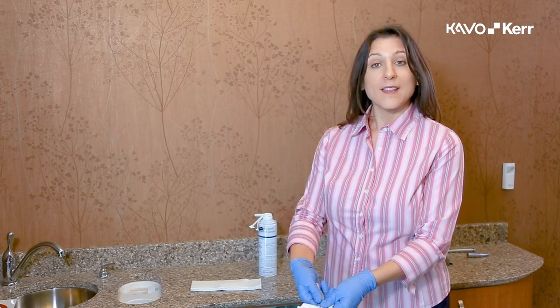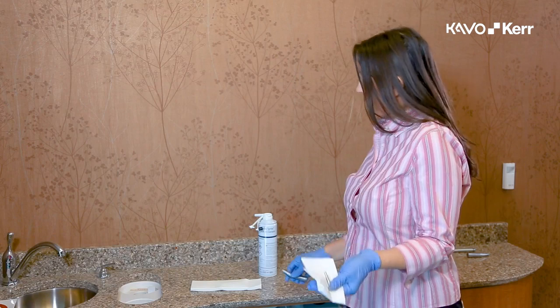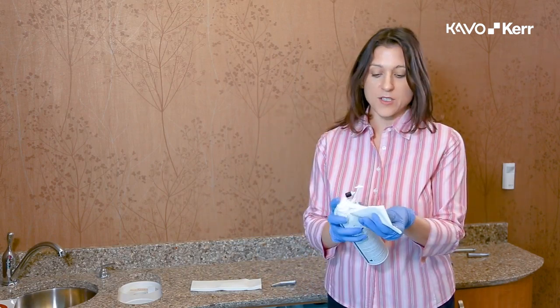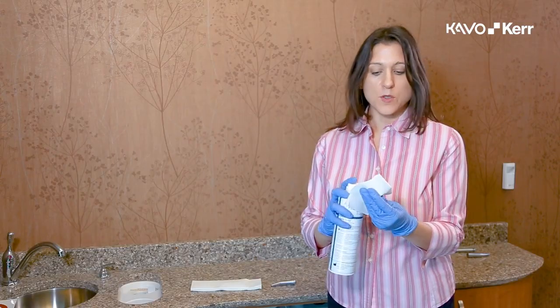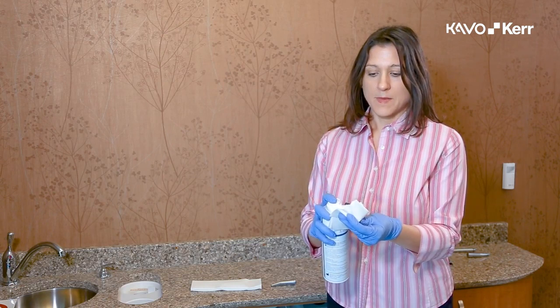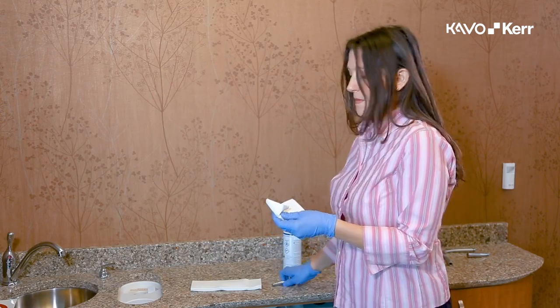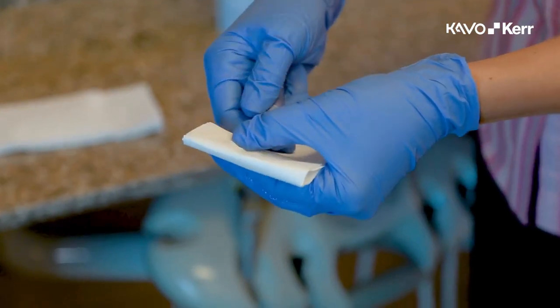Unscrew and remove the head of the attachment. Insert the shaft into the E-type nozzle that is already attached to your can of lubricant. Spray the lubricant for 2 to 3 seconds. Spray each separately. Assemble the attachment back together.